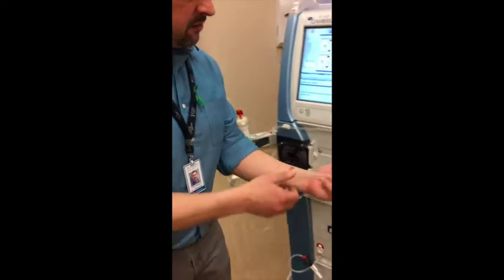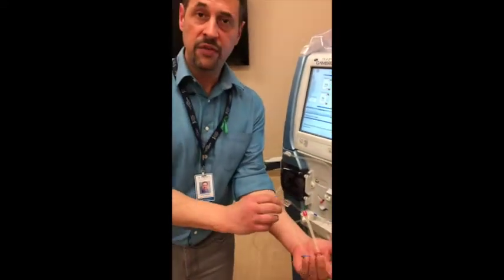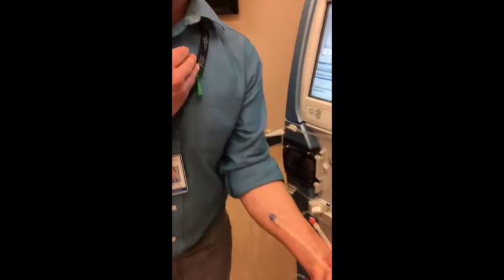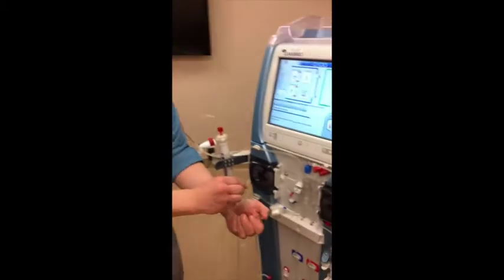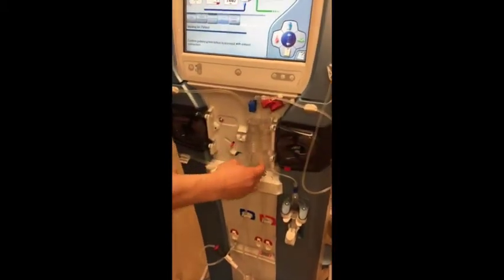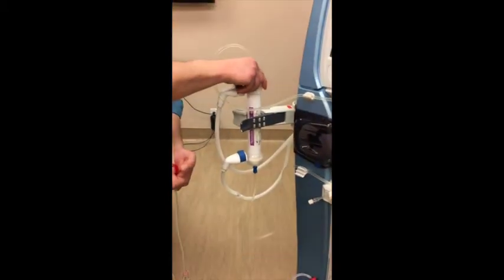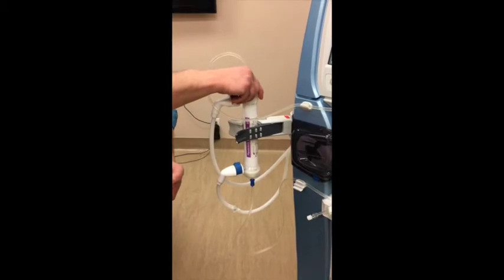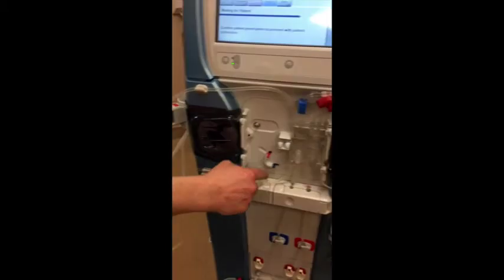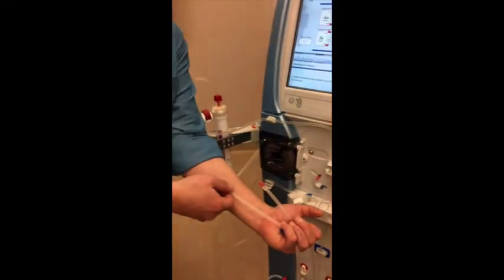I'm going to show how we connect the patient to the dialysis machine. I have disconnected the arterial red and venous blue lines, showing that for the patient it would be connected either at the arm or at the chest. The blood is pulled through the arterial line by this arterial pump, goes through some chambers, goes to the artificial kidney, which is where the cleaning and filtration of the blood occurs.